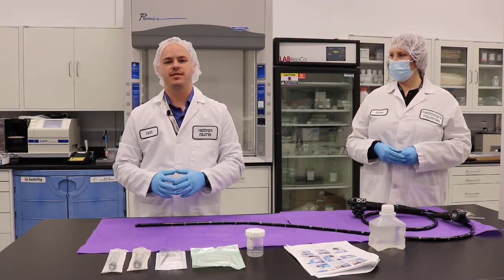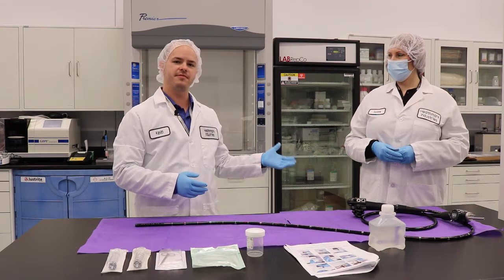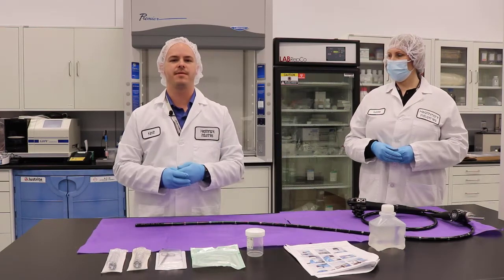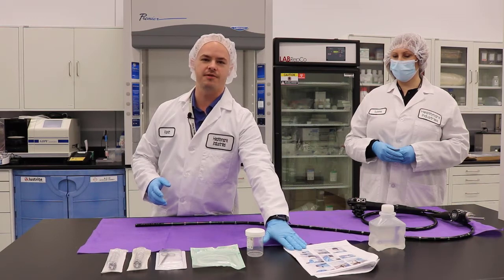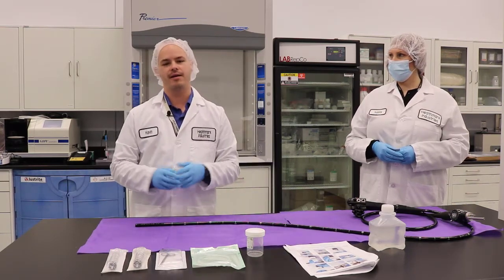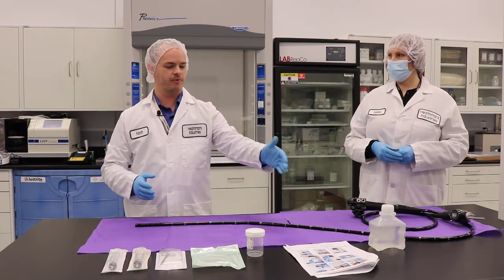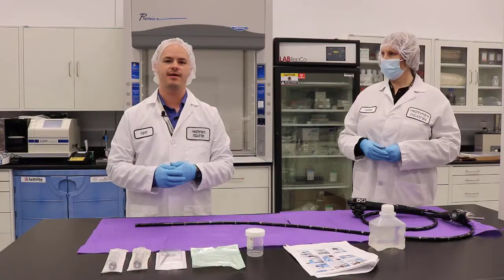Before we get started with the sampling procedure, it's important to remember to have two people. I have with me a facilitator and I will be the sampler. We also want to have our instructions for use handy because we're going to follow those to a T. We will start with step one of the sampling procedure and show you exactly how that's done.